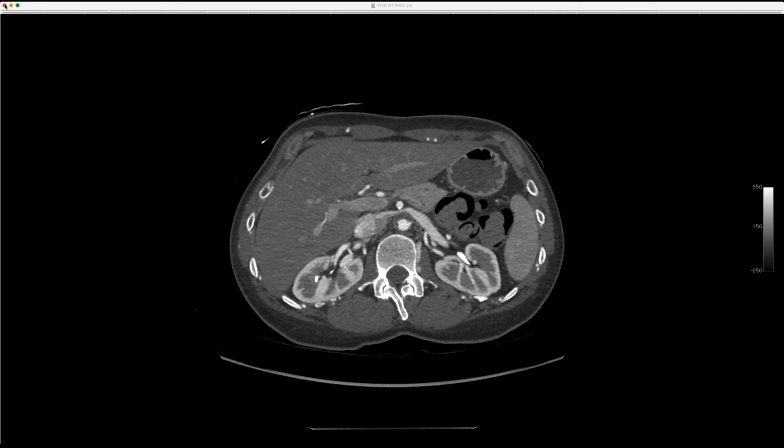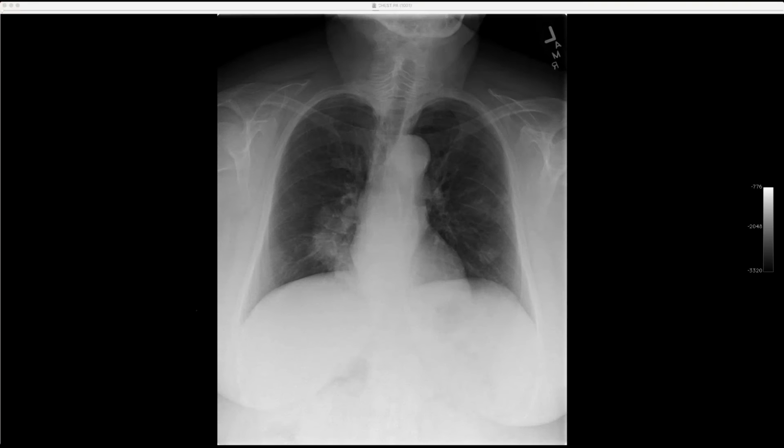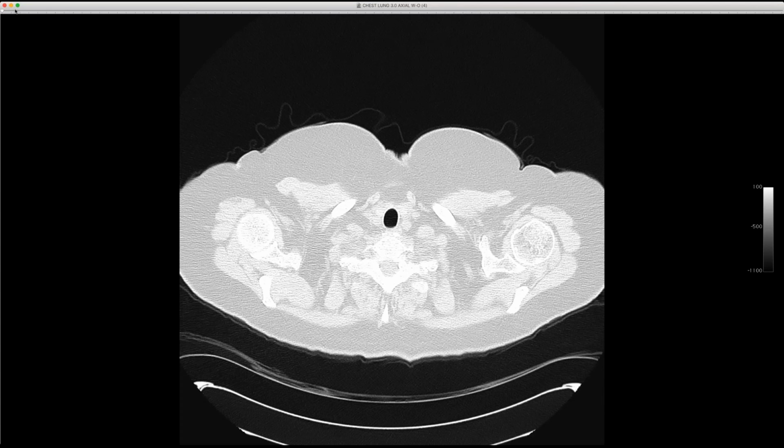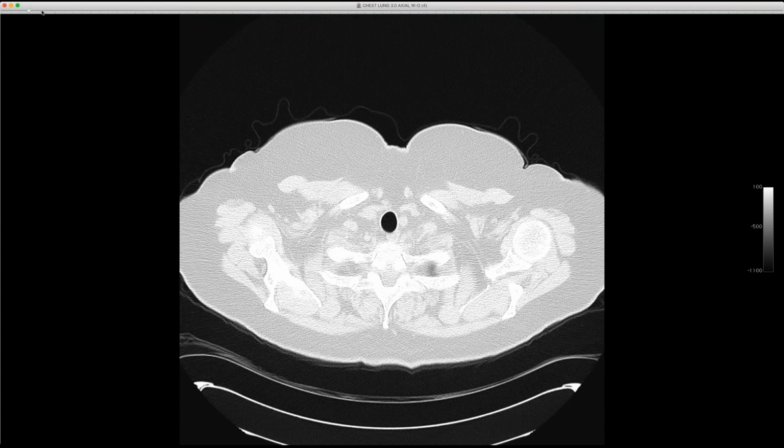Let me show this one because it's something we don't see a lot of. So this is a woman who was referred to one of our pulmonologists for lung masses. Now she's pretty much asymptomatic. You can see there's at least 2 masses, maybe 3 or 4 here. The lateral projection shows these well-defined masses in her lungs. She's got a little area in the esophagus.